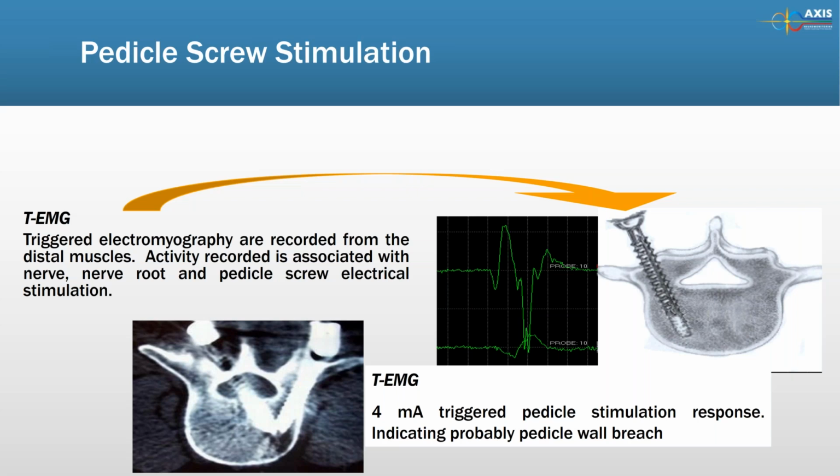Also make sure it's plugged into the cathode, not plugged into the anode. There's no CSF or blood or any type of fluid in the exposed area before you stimulate.